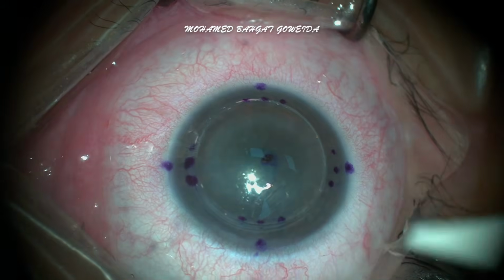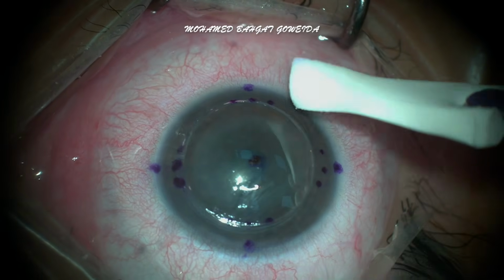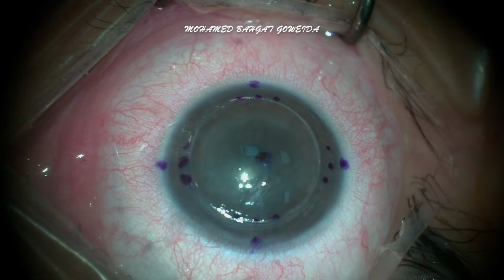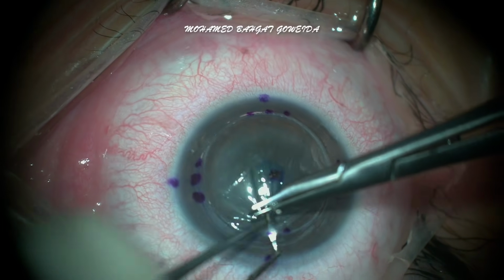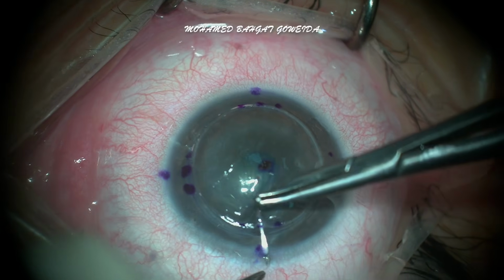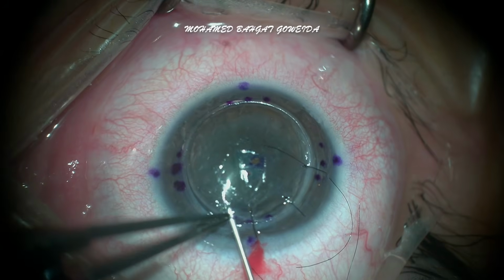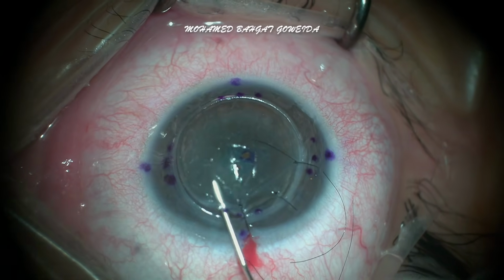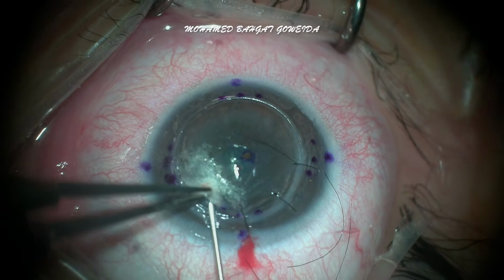However, suction loss occurred after about one turn. So I applied pressure to continue trephination but this resulted in full thickness trephination in the superior part. Suturing of the perforated quadrant was done, followed by intrastromal air injection and paracentesis with air injection in the anterior chamber to avoid collapse of the AC during manipulation.